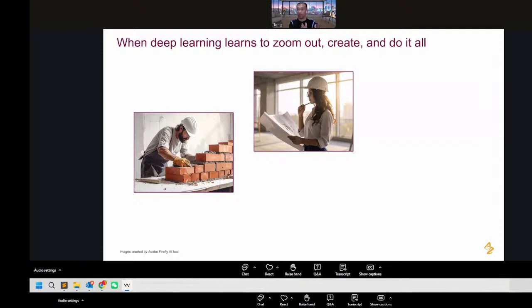So how the build is leveled overall, and is there any defect. That is from a higher level, the whole slide level. That's a different algorithm.